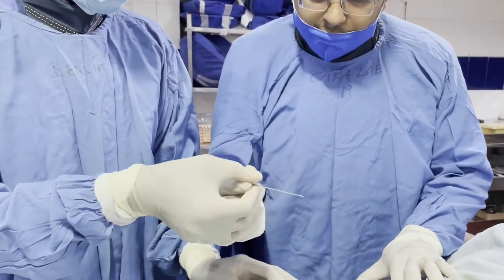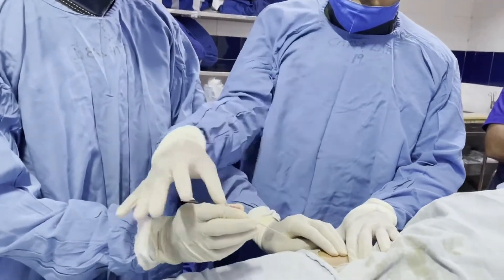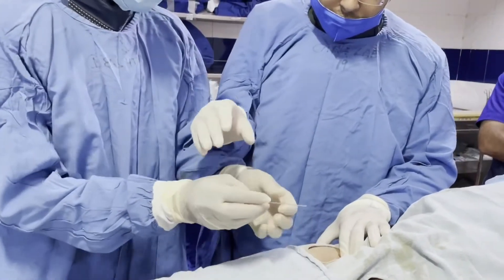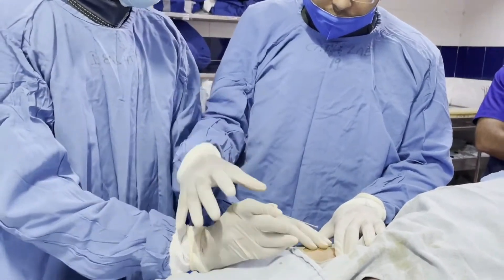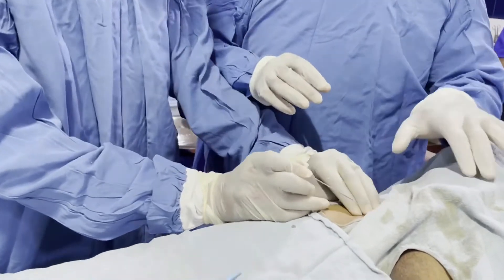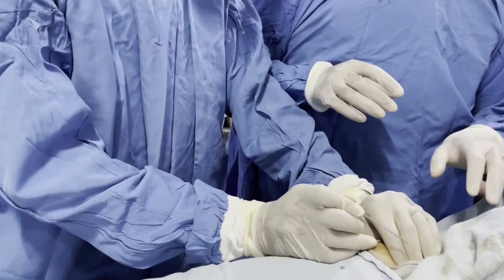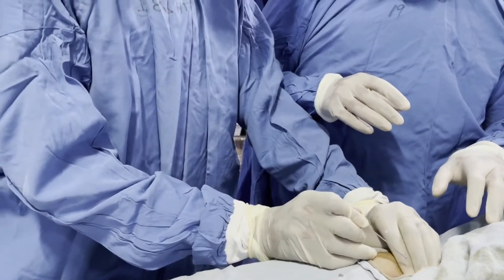We take the needle with its bevel edge up and insert at an angle of 30 to 45 degrees toward the direction of the umbilicus. So from the horizontal plane, it is about 30 to 45 degrees toward the direction of the umbilicus.